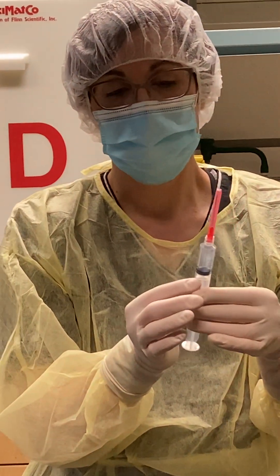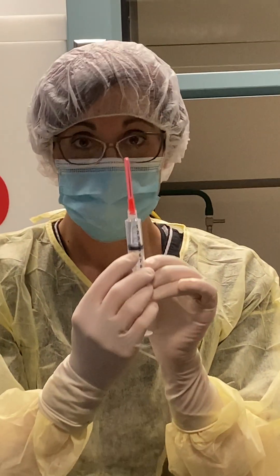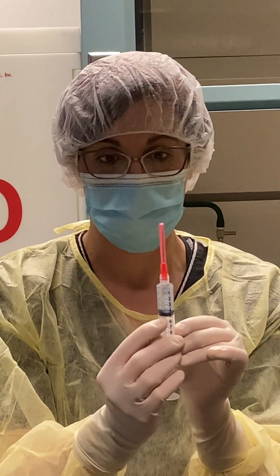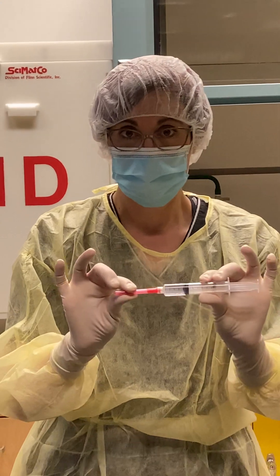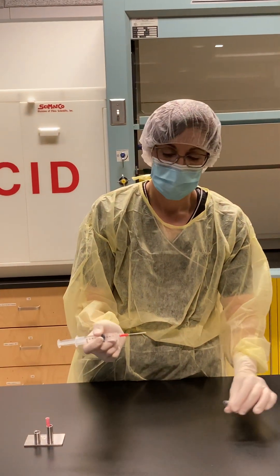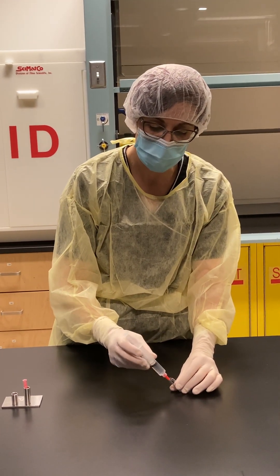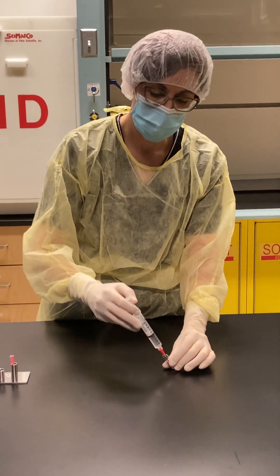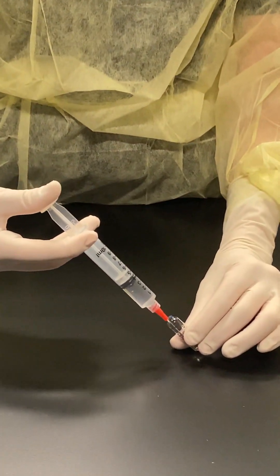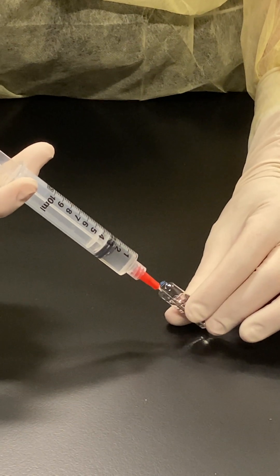In this case I wanted two mils, but as you can see, I drew up over four. So I want to remove the extra volume of fluid — I'm going to remove my needle cap, place my needle back into the ampoule, and carefully push the extra fluid back into my ampoule.